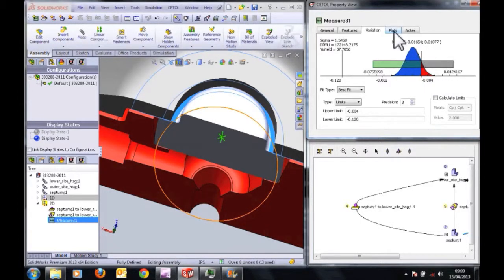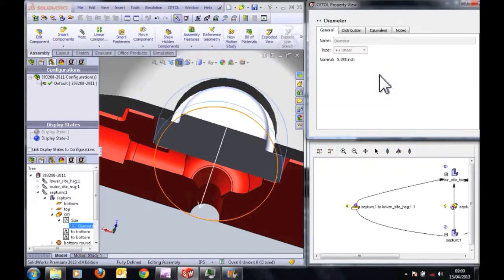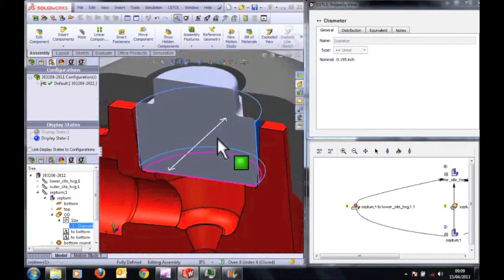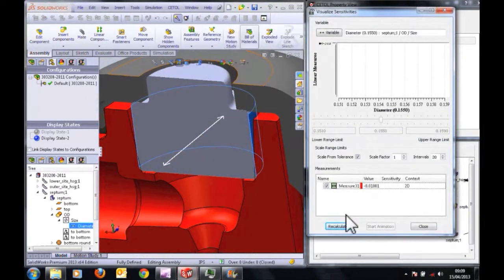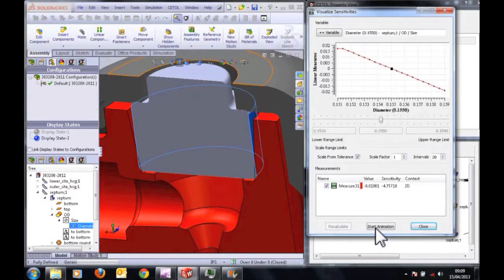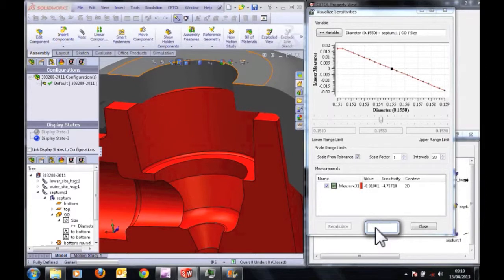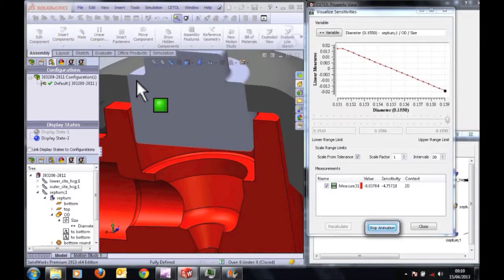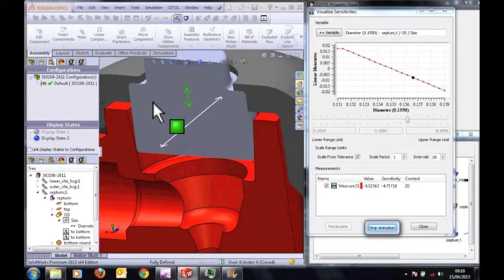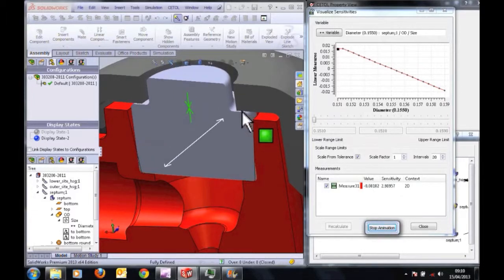But not only can I see the proportion that fail, on this plots page I can see which variables in my model are the ones that really drive that overlap condition, and we can see that it's this variable here which is the big hitter, which is the outer diameter of that septum. And one neat little trick I can do, which illustrates the type of assistance that CTOL can give you in understanding what's going on here, is I can build a little playbook of an animation of that septum moving as that variable I just selected now changes. And what we'll see now is that as the diameter gets bigger, the septum moves up, the overlap increases, and then conversely, as the diameter gets smaller, we'll see that the overlap decreases, and you can see that at the lower limit of the diameter that it even opens up here over the shoulder.